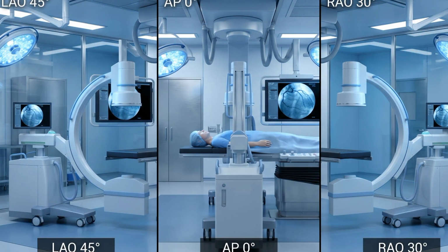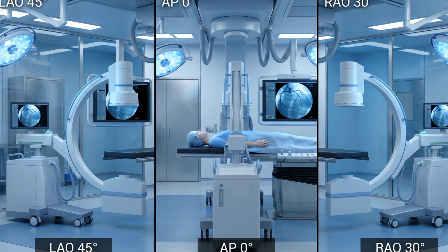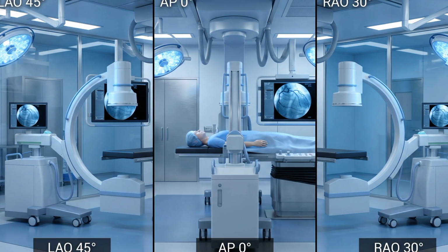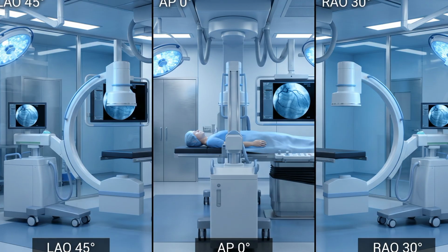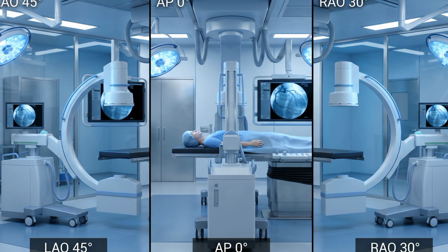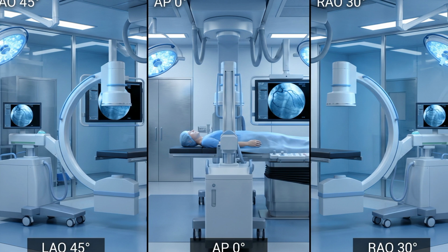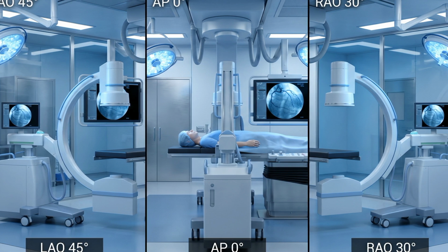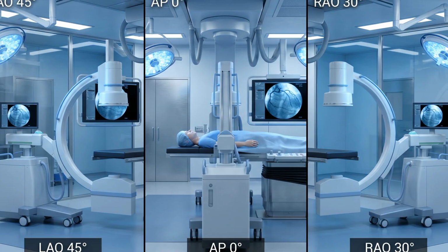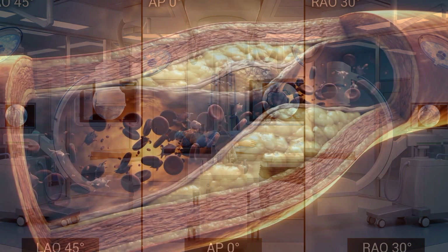Throughout this process, safety is very important. Doctors, staff, everyone wears a lead apron. Why? To reduce radiation exposure. The room is also maintained in a very clean, very sterile environment. You can see in this image how the room is maintained.